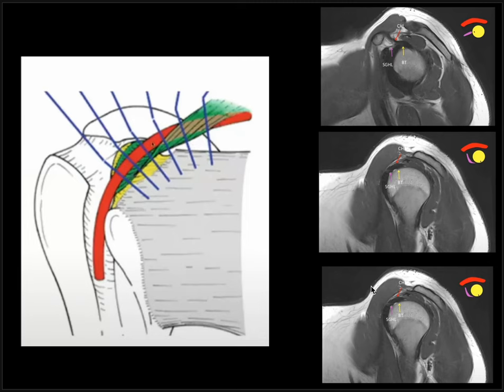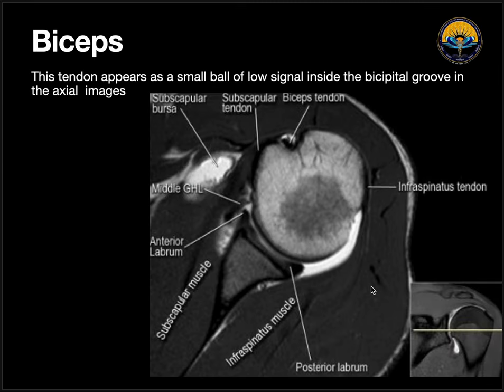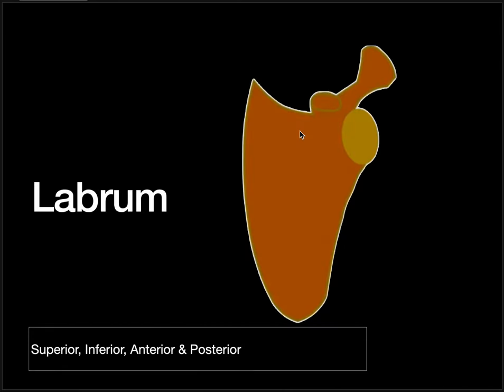On this axial section, we can see the subscapularis muscle, tendon, and insertion on the lesser tuberosity; the infraspinatus muscle, tendon, and insertion on the greater tuberosity; the biceps in the bicipital groove between them; and a transverse humeral ligament above this.